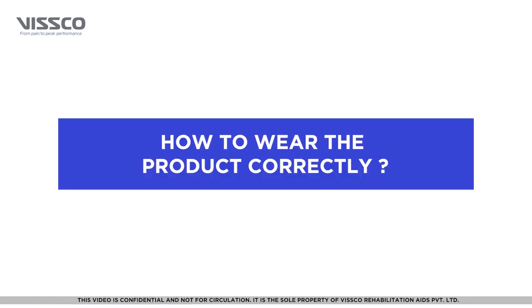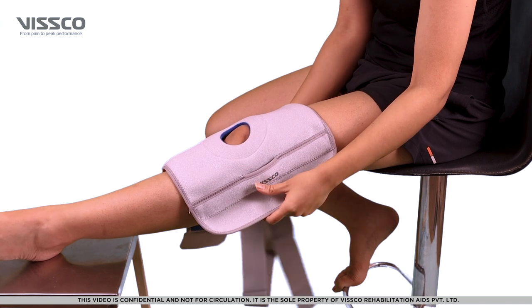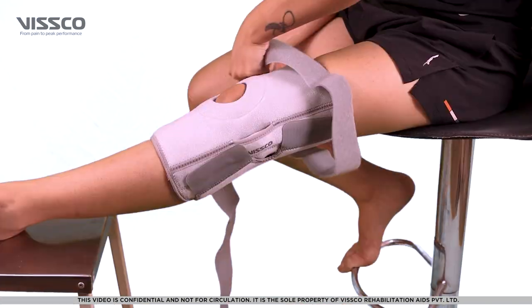Now that you have selected the right size, let's wear the product. First, place the brace over the knee so that the opening on the brace comes over the patella. Now lock the brace with the Velcros to a comfortable and snug fit.